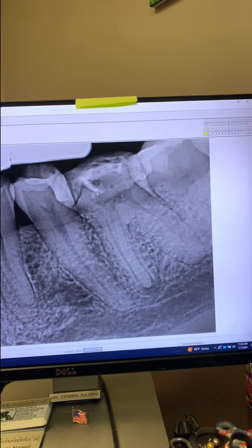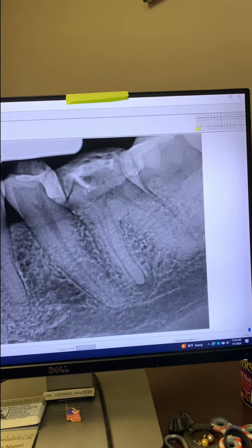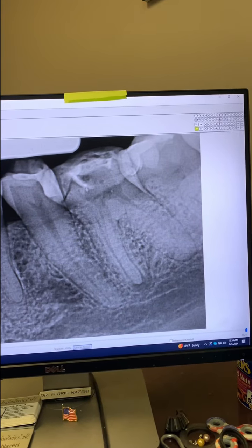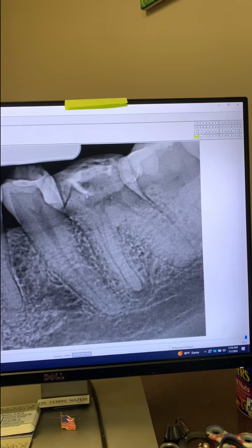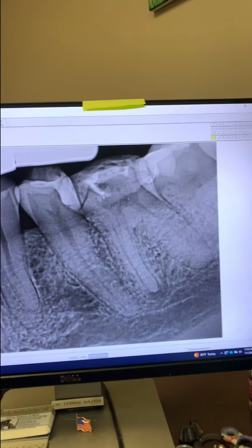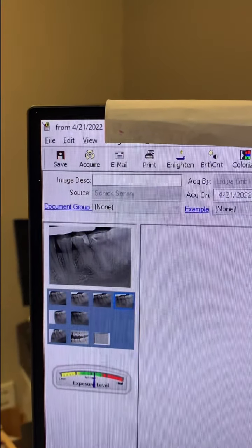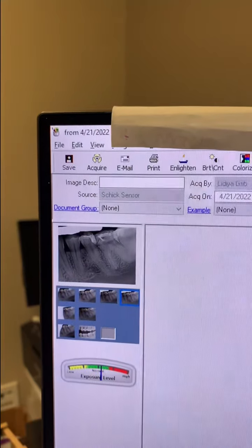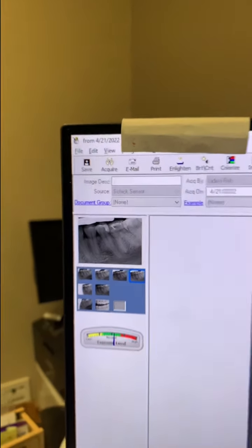So we went over options with the patient. Patient wanted to try to save the tooth. So we went ahead and IV sedated her and did the root canal for her in 1 appointment. IV sedated her because she was already traumatized so much that she had developed dental phobia. And here's the date, as you can see, when we saw her was 2 years ago. Today is 7/1/2024, so over 2 years ago.